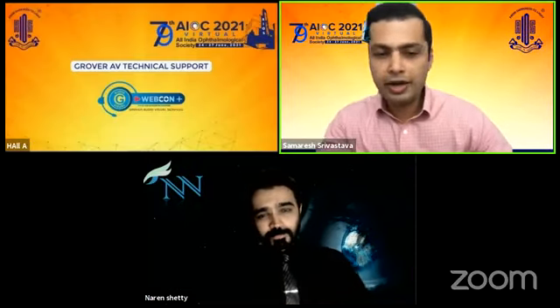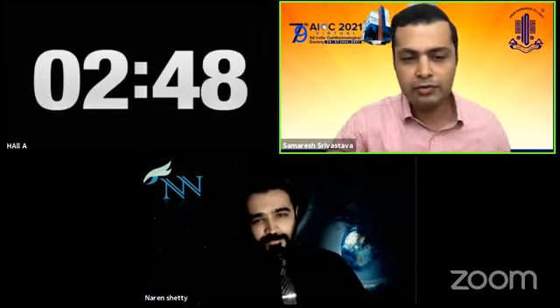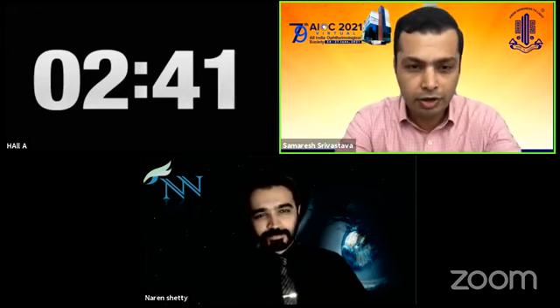So I think that's a great question. For me, my IOP is set at 40. So even for any cataract, I don't go beyond 40. Because now with Infinity, my bottle height was set at 80 for fragment removal, but I am getting away with an IOP of 40 for all my cataracts because the Centurion is pushing in fluid and keeping the chamber stable.